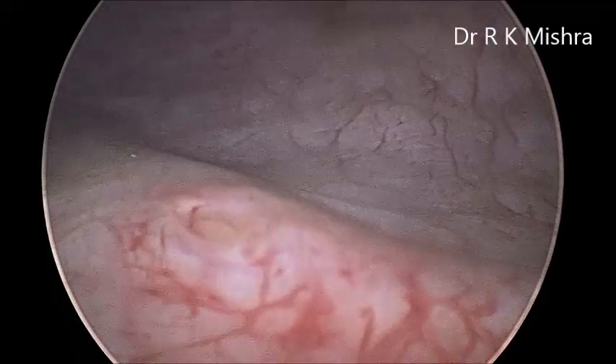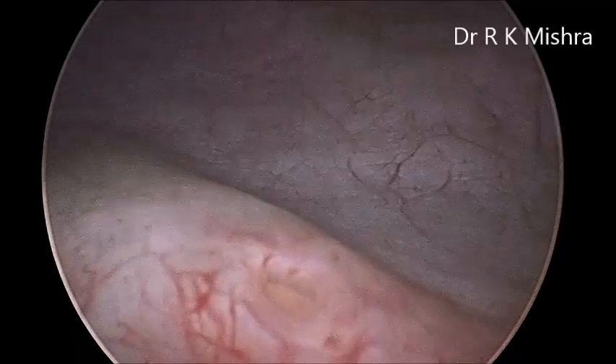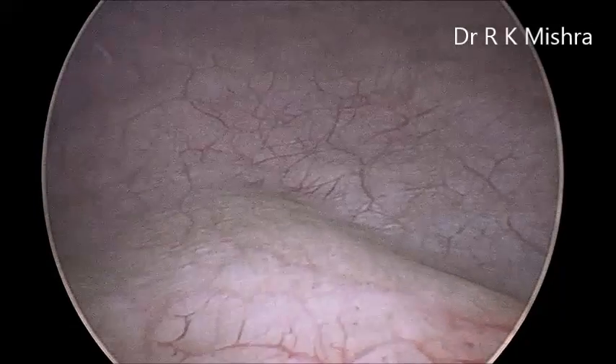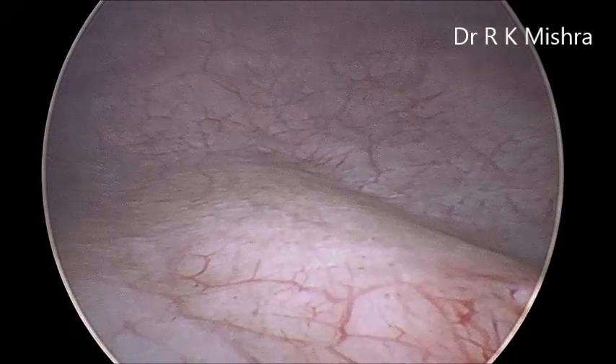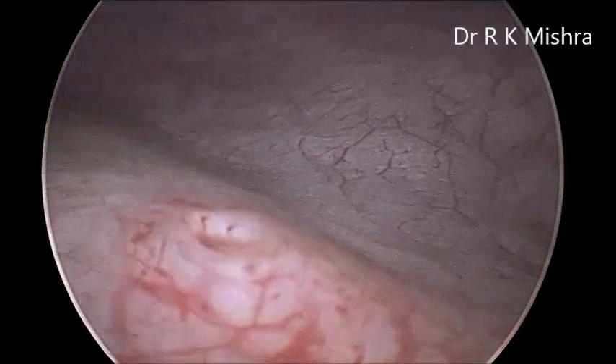This is again the right side of the ureteral opening. You can see the ridge of the ureteral orifice. Sometimes peristalsis can also be observed.